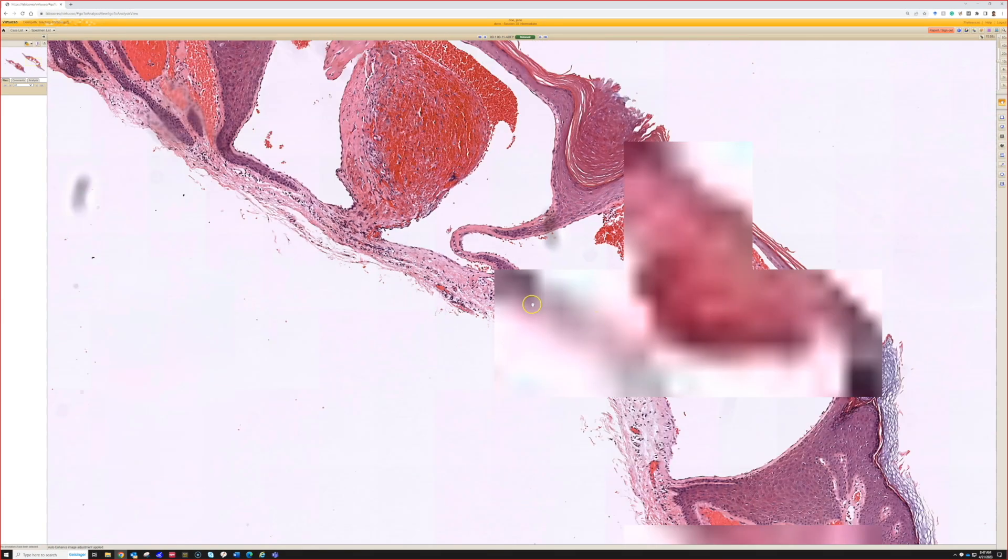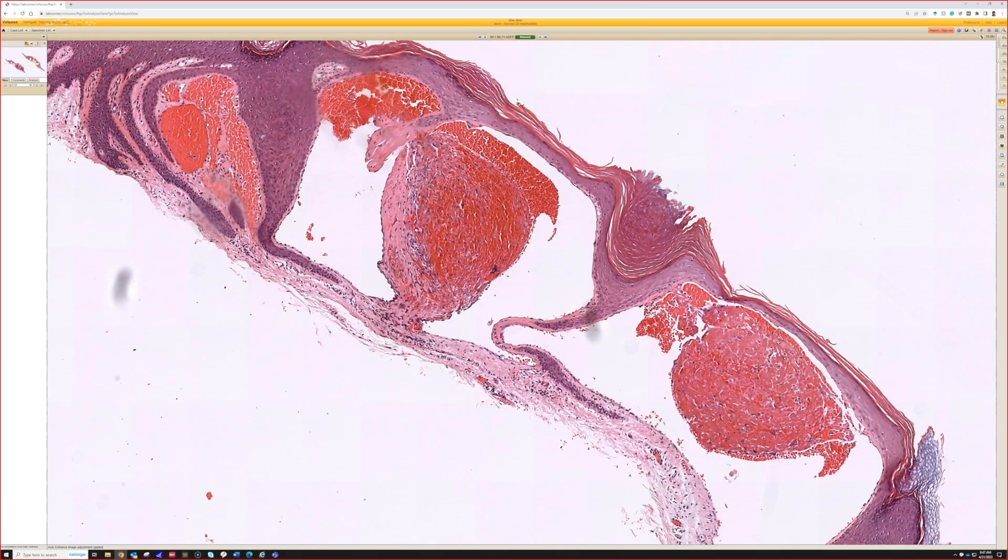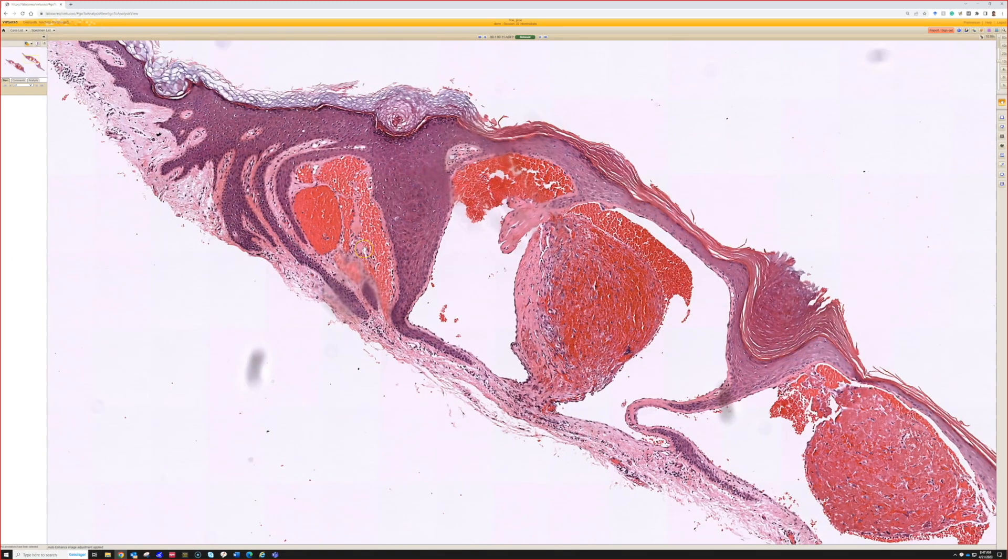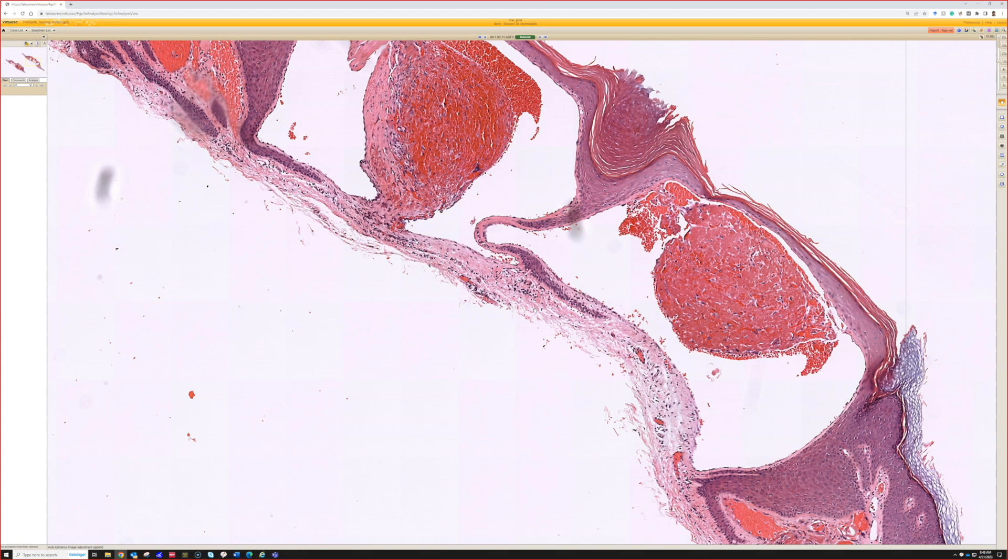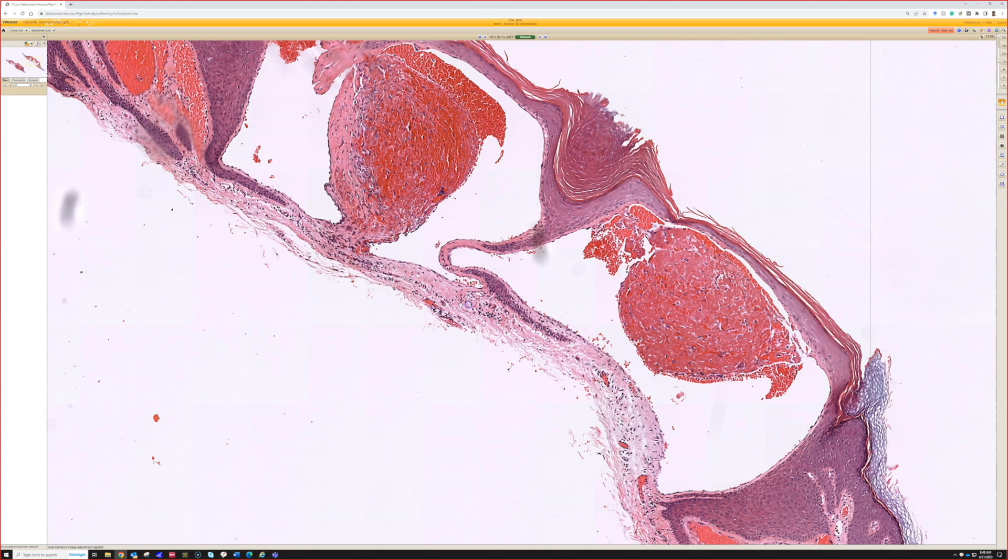The biggest difference also between this and targetoid hemociderotic is one, that the vessels get actually entrapped in the epidermis and two, in targetoid hemociderotic, you'll also, if you have a deep enough shave, see those little thin slit-like channels that are compressed and trickling between the collagen down below. Whereas in true angiokeratoma, you just see these big cavernous spaces up top without those down below.